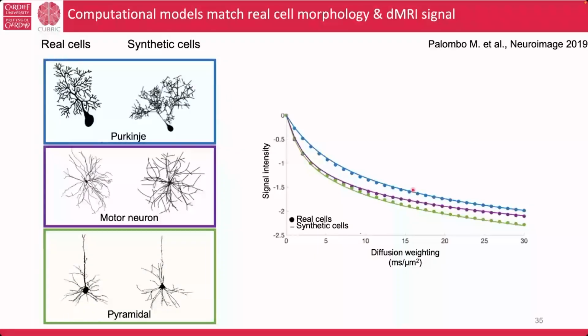And within also, this is also noise free. If you add the noise, they are basically identical. So this means this test, and there are other tests in the original paper, mean that we can use this generative model to create morphologically accurate copies of each cell type.